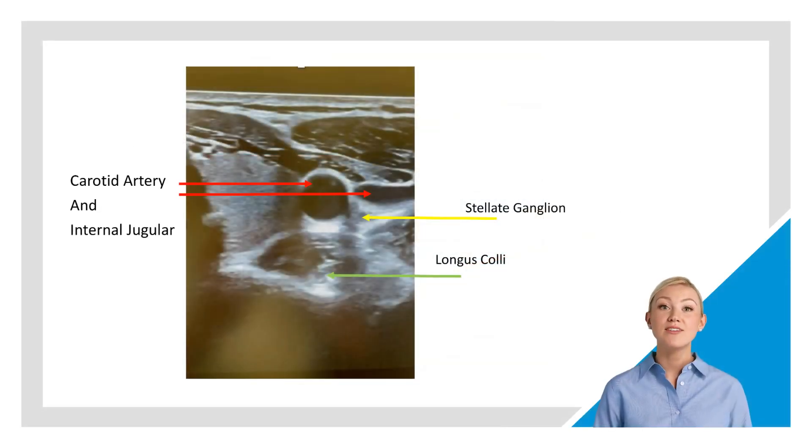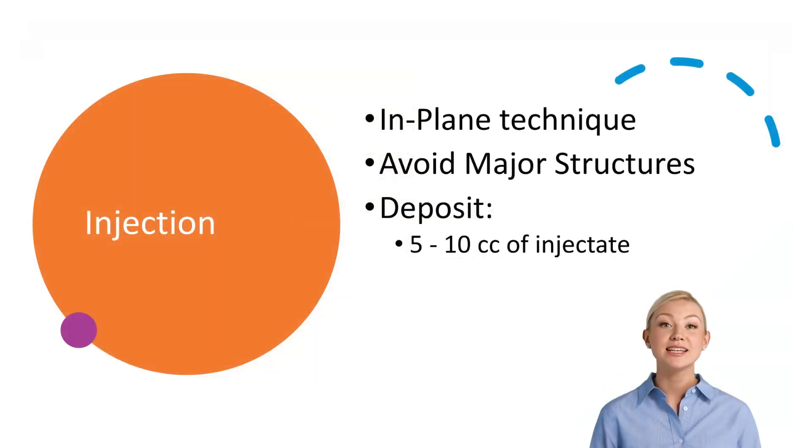Once we arrive at this view, we note the carotid artery and jugular vein anterior to the ganglion, as well as the longus coli posterior to the ganglion. Using the in-plane technique and avoiding major structures, deposit 5-10 cc of injectate to ensure spread to the level of C7.